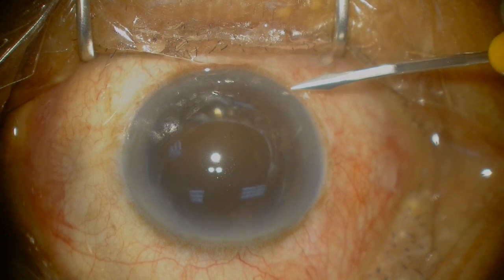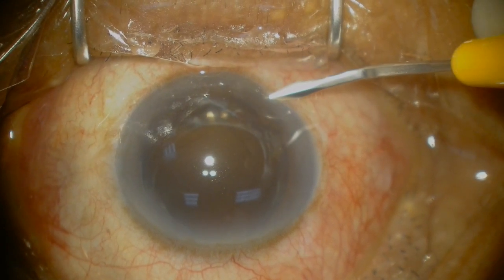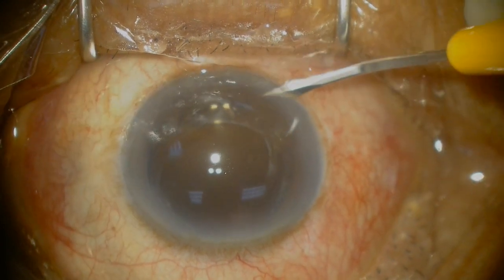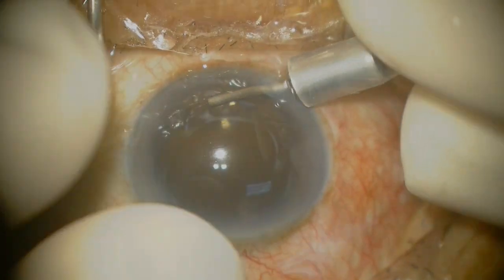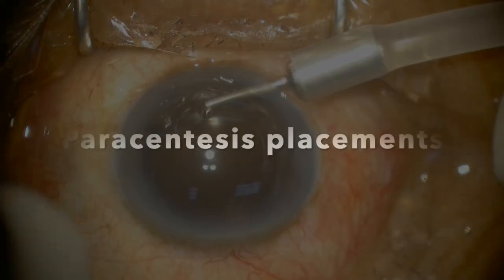My first tip is to use an AC maintainer. The paracentesis here is created with a 1mm side port knife at about the 7 o'clock position, and an AC maintainer is inserted here to maintain a pressurized globe.